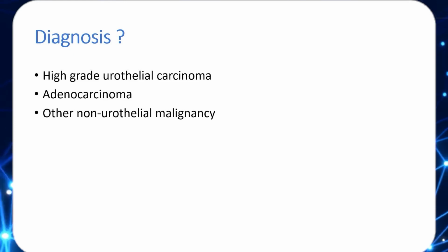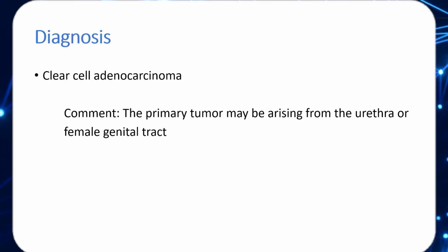Sorry? I think I heard the answer from the audience. Non-urothelial, I think you are right on track. So this was a real gutsy call. We called it clear cell adenocarcinoma, based on the appearance and the presence of the protein.